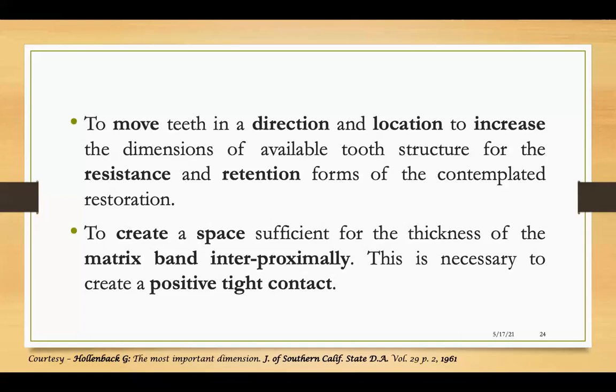To move teeth in a direction and location to increase the dimensions of available tooth structure for the resistance and retention form of the contemplated restoration. To create a space sufficient for the thickness of matrix band interproximally. This is necessary to create a positive tight contact.